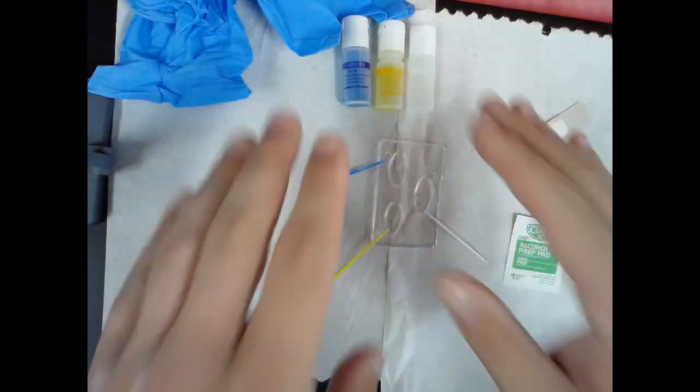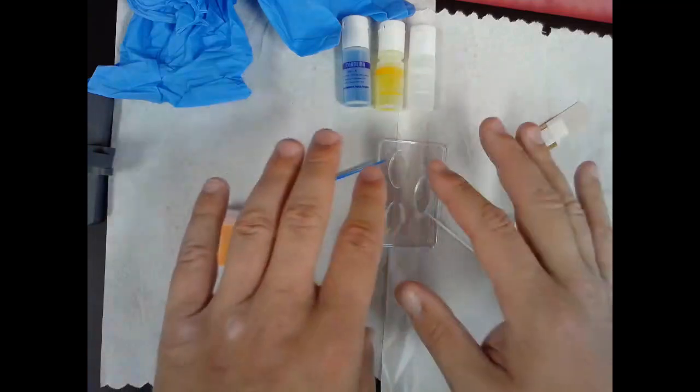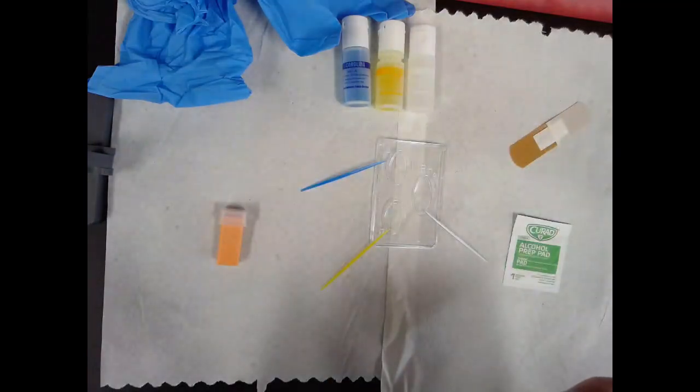An antigen is a unique surface marker to a cell that has the potential to stimulate an immune response, especially if it is a foreign antigen, meaning that's something the immune system has never seen before or encountered. And then we are using antibodies to try to tag these antigens on these red blood cells to see if they are present or not.